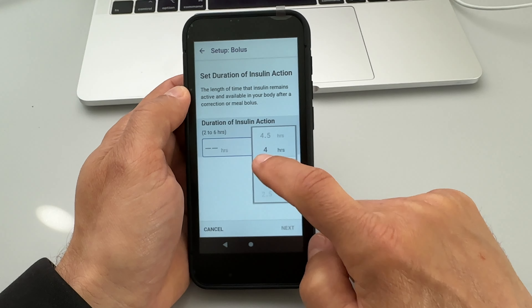To put your first pod on you will need: a new pod, the controller, approved insulin such as NovoRapid or Humalog, an alcohol wipe, an overtape if you'd like to use one, and of course a Dexcom G6 CGM sensor and transmitter if you'd like to use the system in auto mode, which I would definitely recommend.